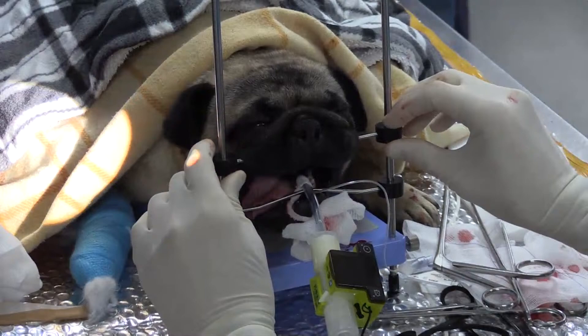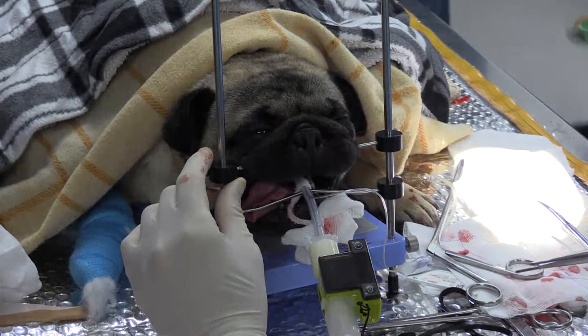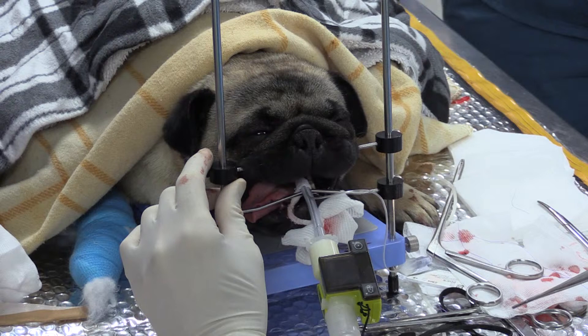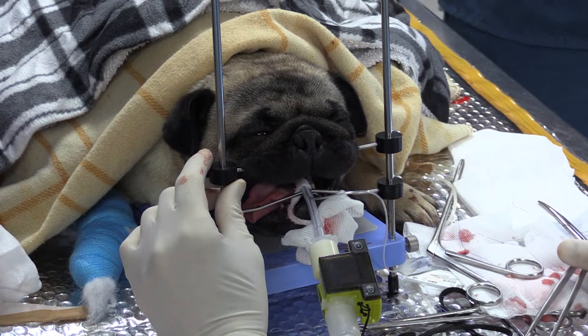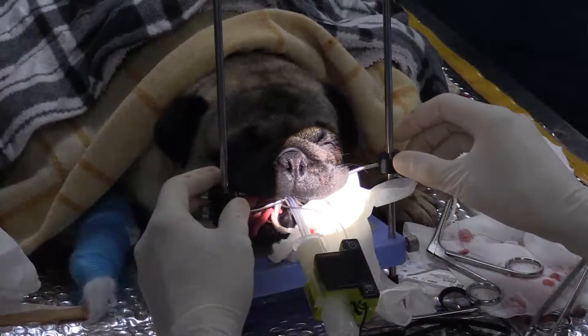Now that we're finished, we're going to go ahead and replace the ice fingers. That's a finger glove full of ice — I'm just going to stick it back in here to ice the soft palate. I'll remove the brace.